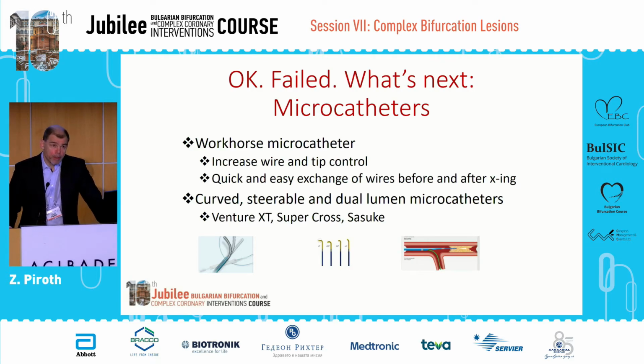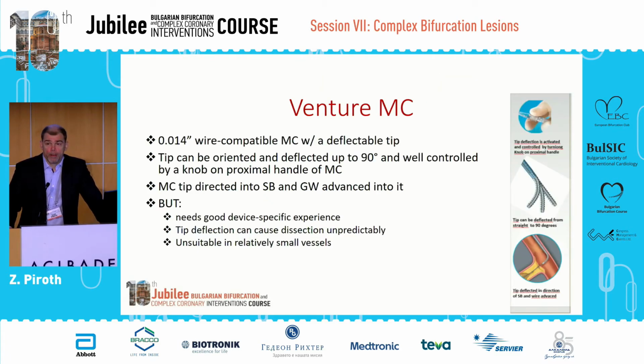But there are special microcatheters, and I'm not sure we are all familiar with those. There are curved, steerable, or dual lumen microcatheters. Like this one, the Venture microcatheter is a 0.014-inch wire compatible microcatheter with a deflectable tip. The tip can be oriented and deflected up to 90 degrees and well controlled by a knob on a proximal handle of the microcatheter. And thereafter, the microcatheter tip can be directed into the main side branch, and the guide wire can be advanced into it.